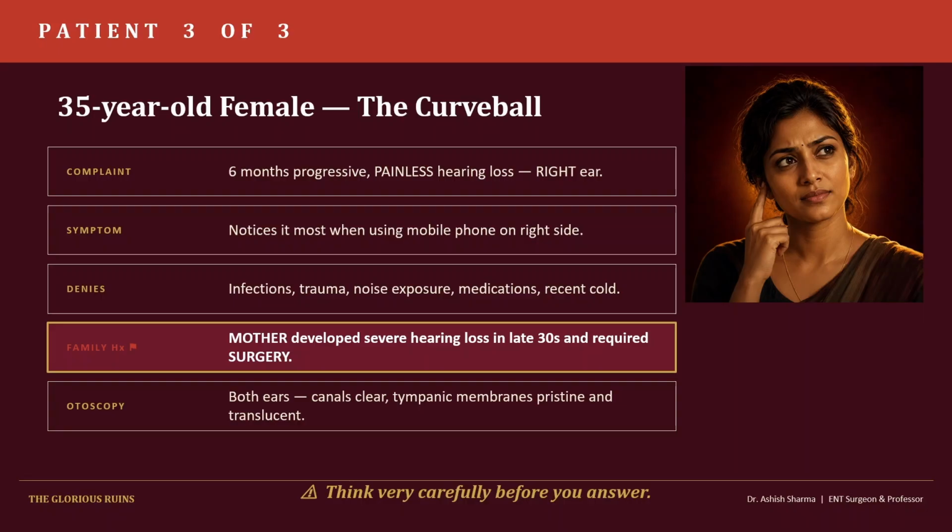It is quiet, but definitely there. Right Rinne test, positive. Air is beating the bone again. I pause, I repeat it to make absolutely sure the result is the same. Left Rinne, again positive, normal.